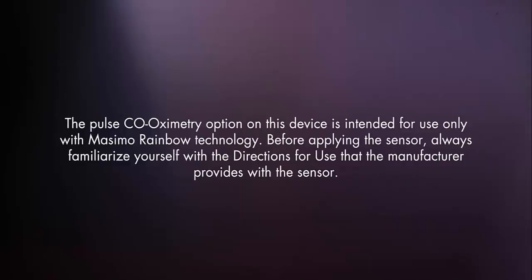The pulse co-oximetry option on this device is intended for use only with Masimo Rainbow Sensors. The PRO-PAC-MD can measure SpO2 with reusable or single-use sensors. Before applying the sensor, always familiarize yourself with the directions for use that the manufacturer provides with the sensor.